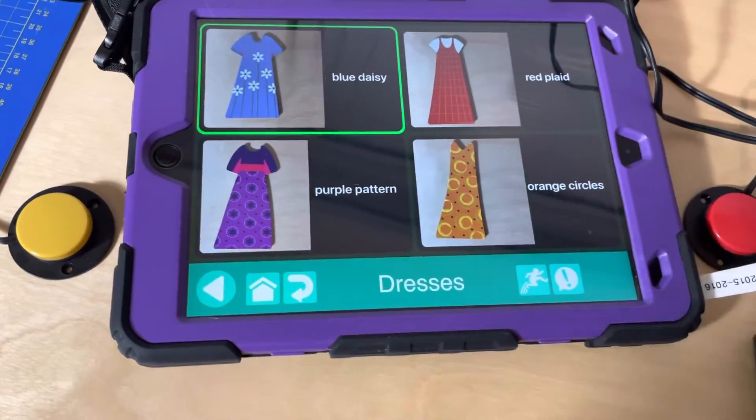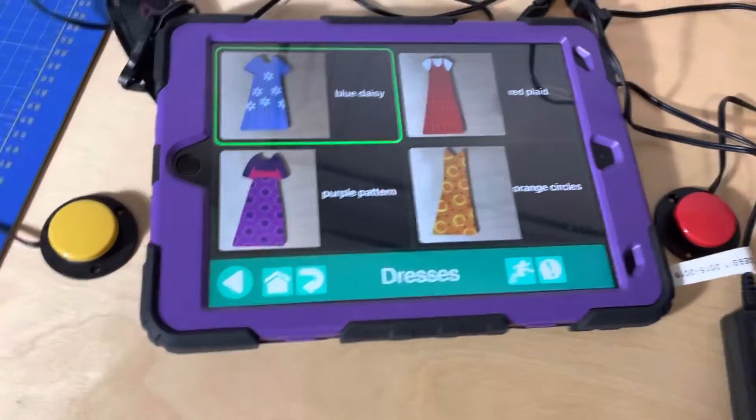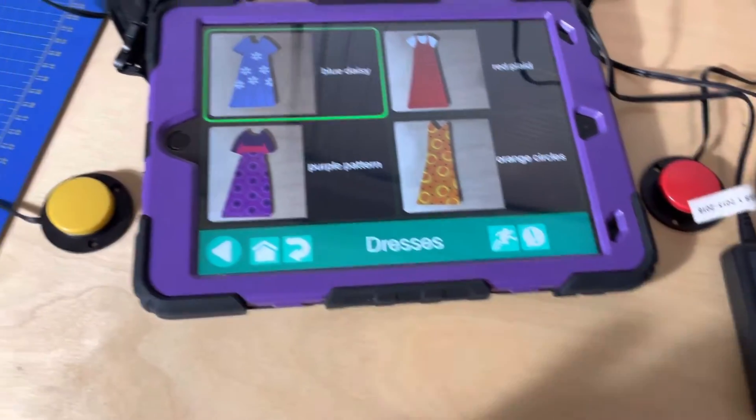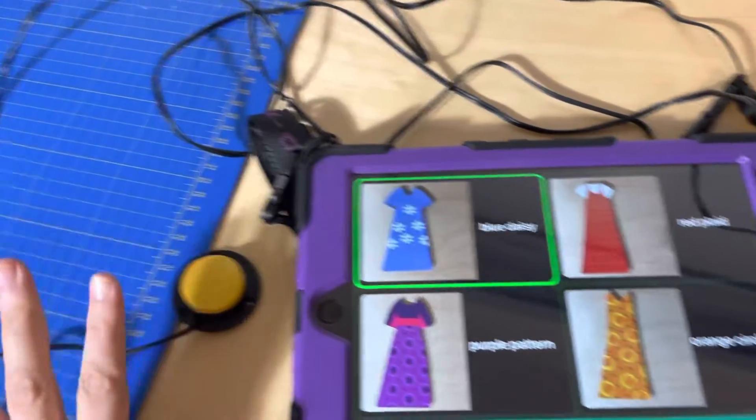One thing I like to do when I'm teaching step scanning is turn on single shot mode. Right now, single shot mode is not turned on in my Praetorian, and I'm going to show you what that looks like. If our student is learning to come onto the switch and come off, in the perfect world they'd come on and come off and it would only move one spot.